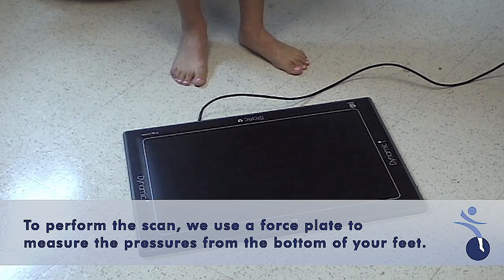To do a proper orthotic scan, we use an electronic force plate that measures the pressures off the bottom of your feet.